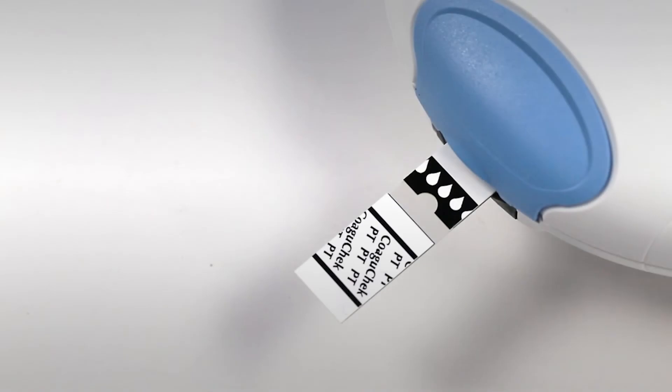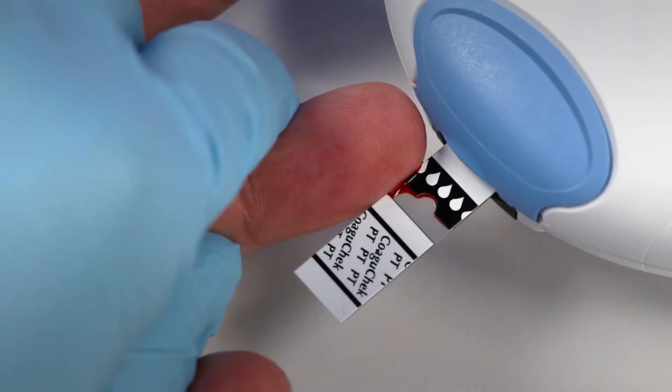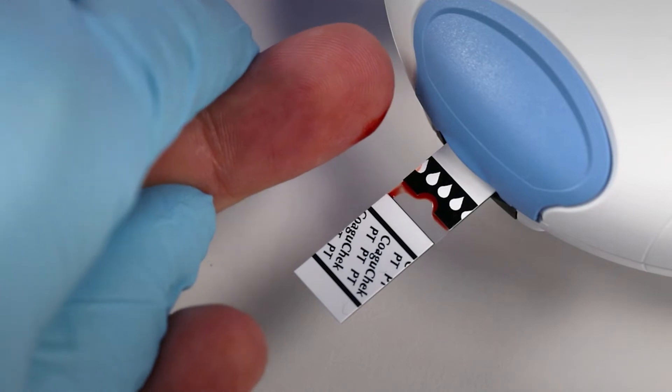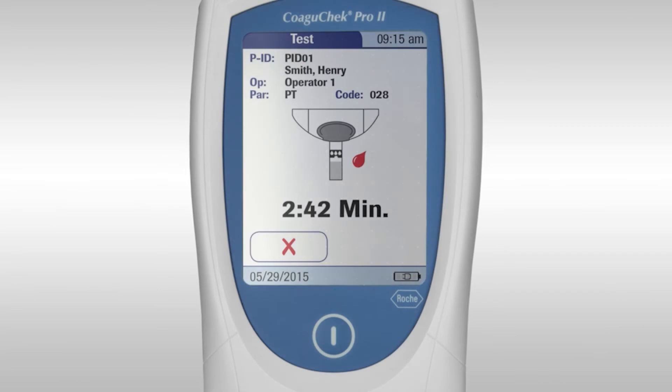The sample volume required is 8 µl — this is approximately the size of a ladybird. When you have a sufficient blood sample, guide the finger to the test strip and apply the blood to either the top or the side of the clear section of the test strip. You must apply the first drop of blood within 15 seconds. The test strip works by capillary action. Hold the finger to the clear section of the test strip until the flashing blood drop icon disappears, which indicates there is sufficient sample for the test.